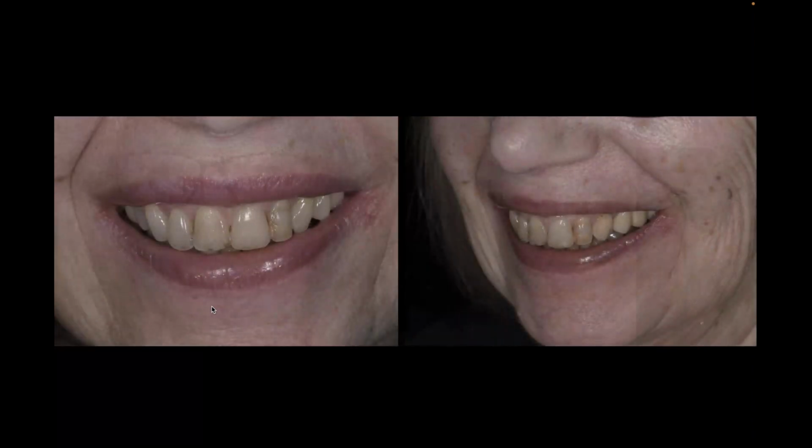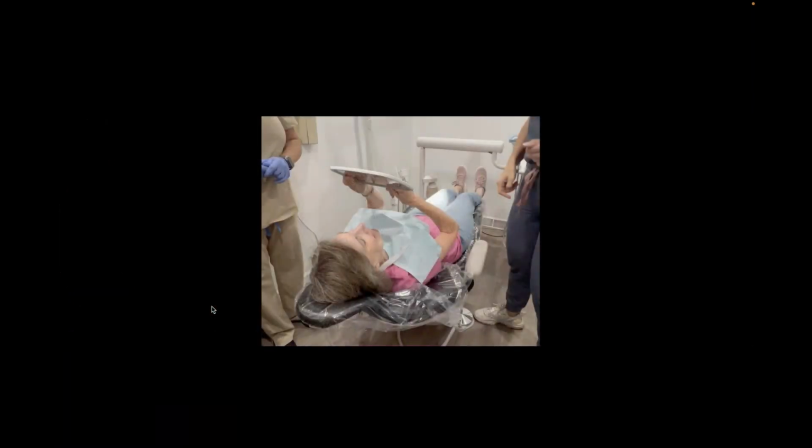I went and did a normal diagnostic wax up. We made her a provisional. And that provisional, this is a little old, so it's yellowing on us already, but you can see the provisional kind of works, but it didn't really work for me. It kind of felt like some things just didn't look right with it. But I think we missed it at this point because I actually went forward. I made the final veneers. I made them kind of bright and white, a little narrower. I tried to make them fancy.